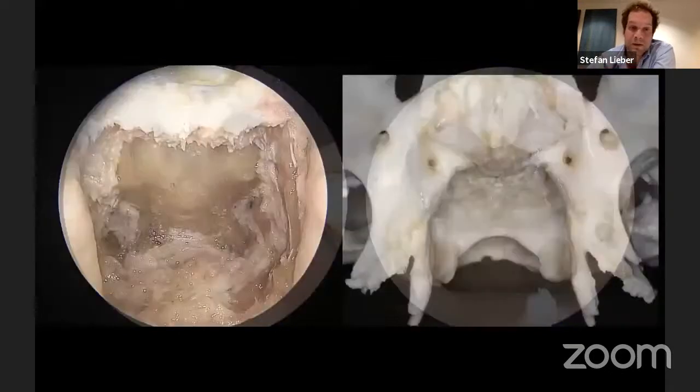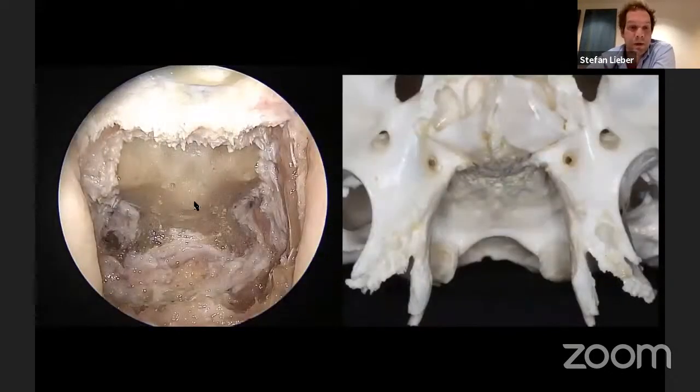And if this is taken down stepwise, this is again the pharyngeal tubercle. The attachments of these 2 muscular layers, taken down, expose the inferior clivus, the anterior aspect of the foramen magnum. And then we would have the connection with the odontoid process here.